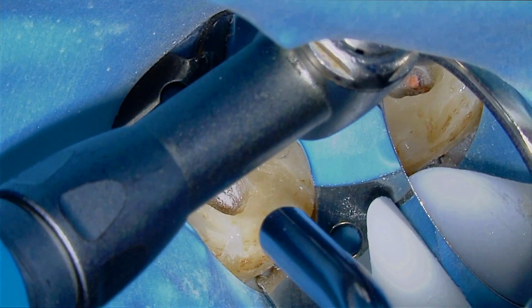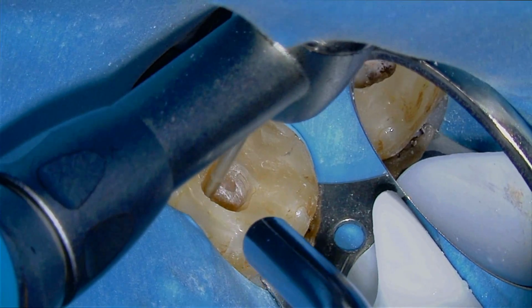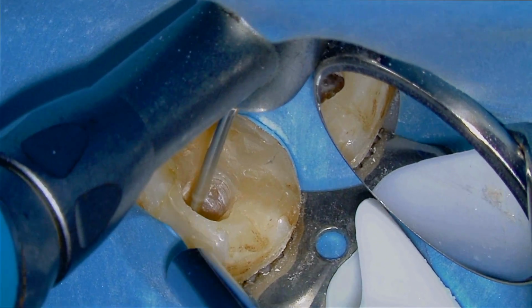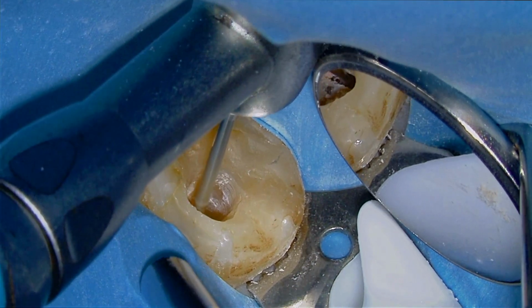So we're going to get into the orifices a bit. I know that the diameter of this round burr is 1 millimeter. So I'm not too concerned just in the top millimeter of my orifice, because I know that the Wave 1 Gold medium that I use is a 1.13 diameter. So I'm safe with that. And at the same time, I'm going to trough buccal to lingual, looking for that middle mesial canal.